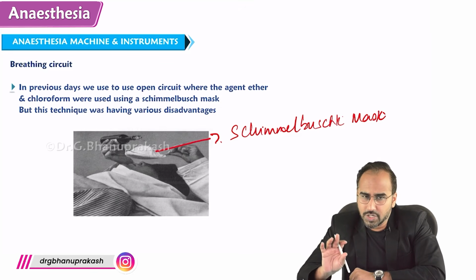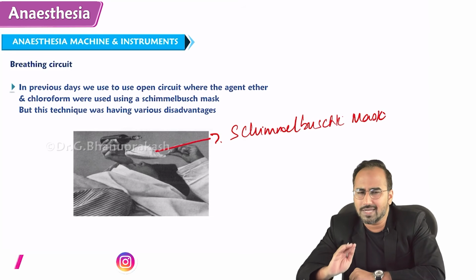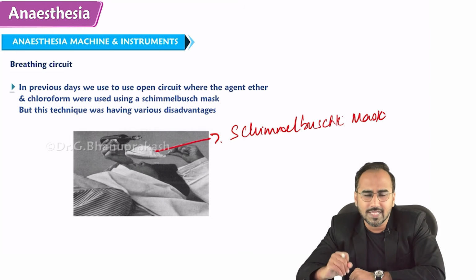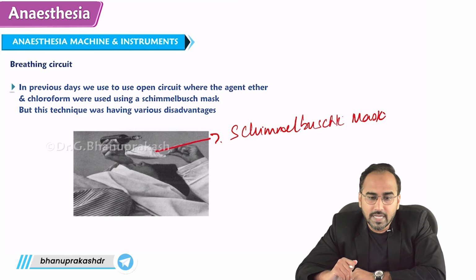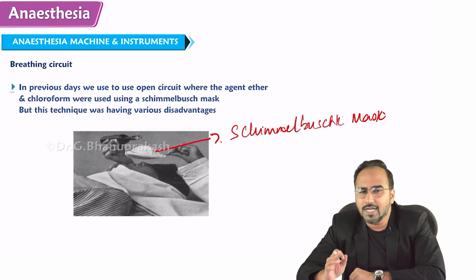As you are pouring the drops of ether on the patient's mask and telling the patient to inhale, sometimes you are nearby those ether drops. Sometimes you might inhale the ether and become drowsy. Sometimes there might be some curious surgeons. They will be like, what is happening? They come nearby the patient and what will happen? They become drowsy. Under drowsiness, is surgery possible?